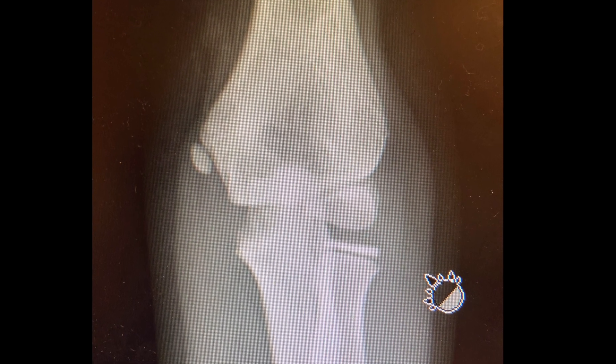If doubt remains as to the presence or the type of injury, contralateral films can be obtained, as seen here.